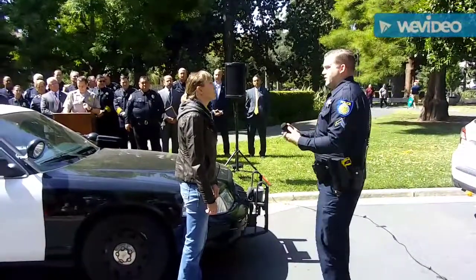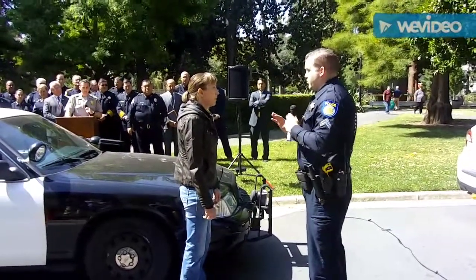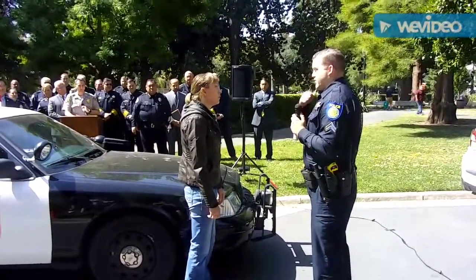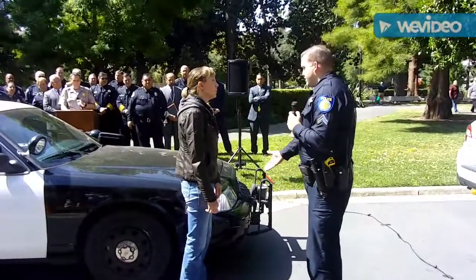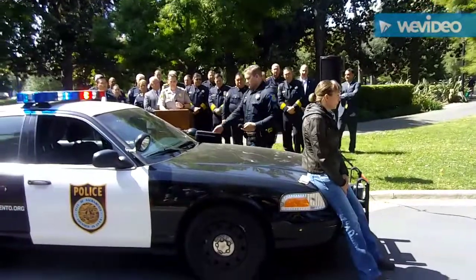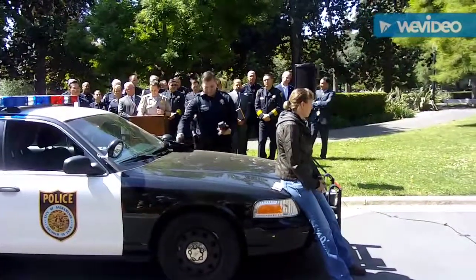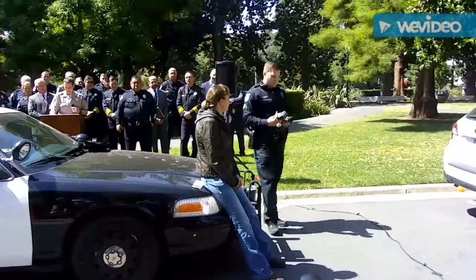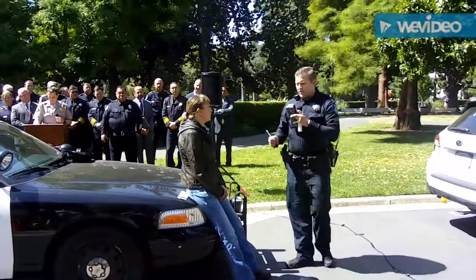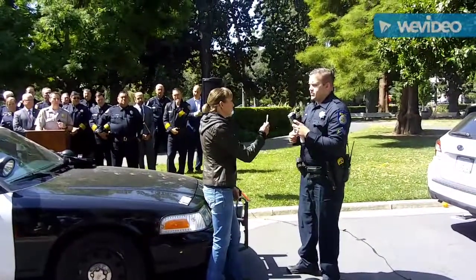Based upon my knowledge, I'm going to have you do one more test for me, okay? It doesn't require you to do anything else but stick a device into your mouth, and I just need to collect some saliva. So again, have a seat right here. Can you go ahead and put this device, the white tip, into your mouth by your cheeks and just collect your saliva on it?